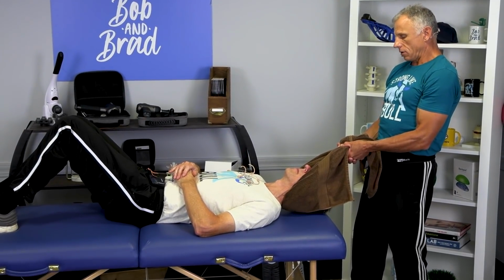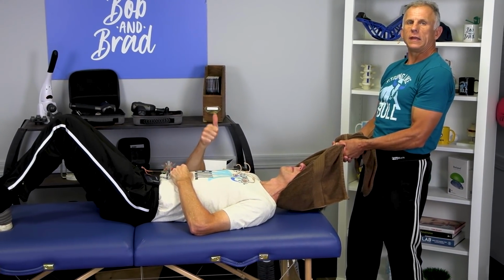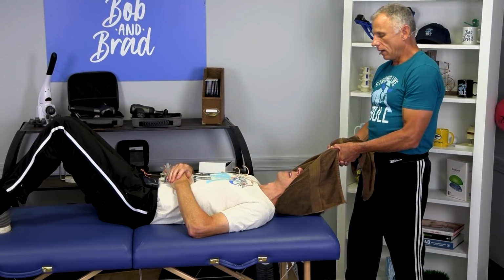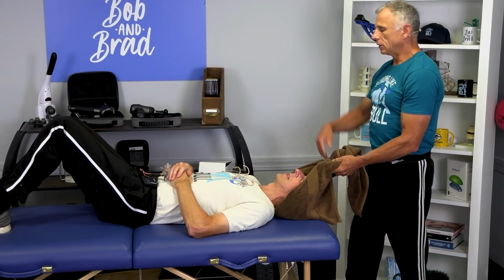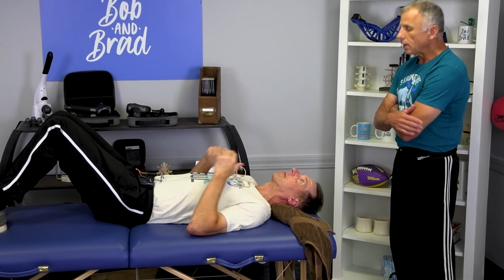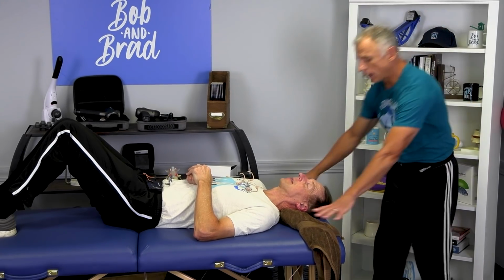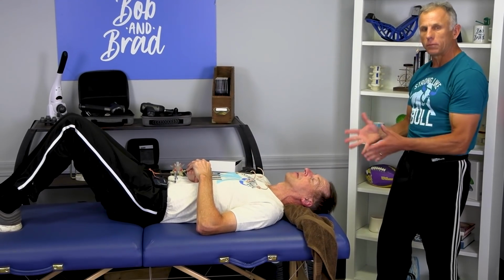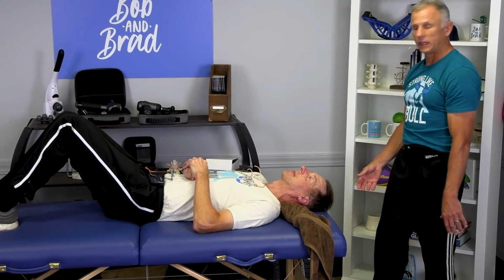And Bob can talk now if you want to chat a little bit. He's always communicating with me if it feels good. And then I'm going to let off slowly, see how the response is. Kind of saw, Brad, that was more traction, but it was still comfortable. So Bob was saying I had more traction than with my manual with the hands, and it was more comfortable. Is that because of the towel roll? Nice and soft. Yeah, the soft towel roll. It wraps around, distributes the pressure where it's supposed to, nice and evenly.